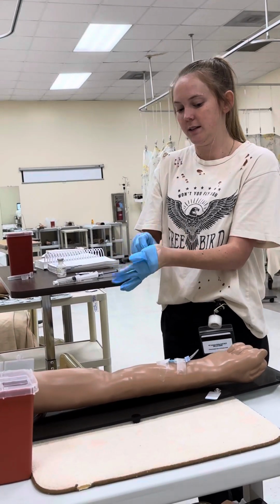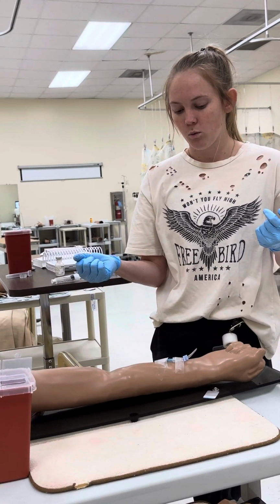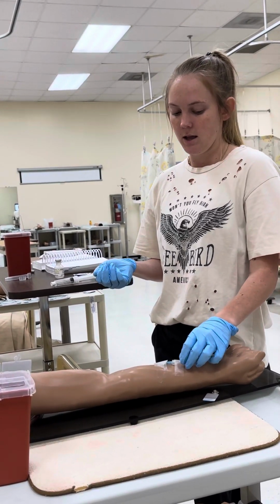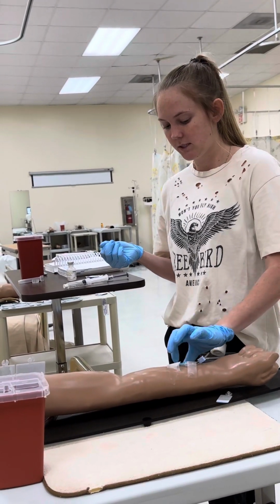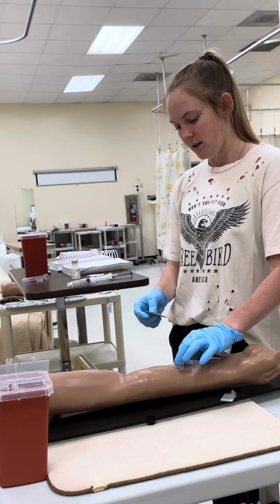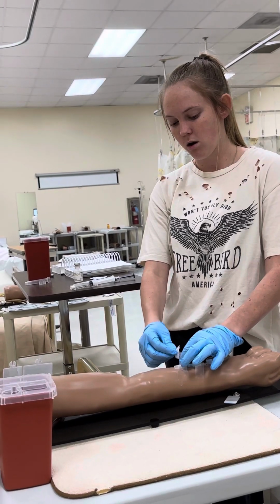I'm going to assess the site for patency and any redness, edema, or warmth. I would clamp off any other IVs that they have going, making sure that our IV is unclamped, and I will uncap the INT using an alcohol swab.